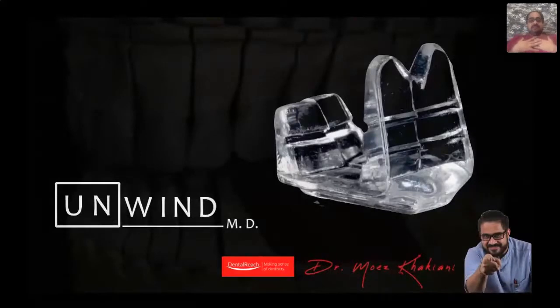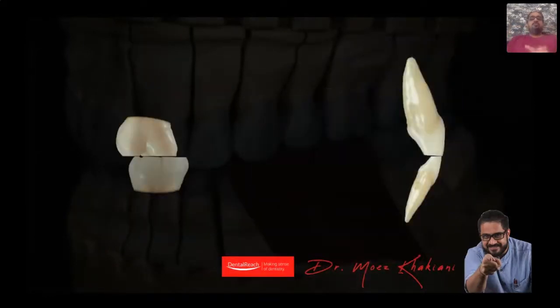I, in my practice, do this with the help of Unwind MD. It is a prefabricated anterior deprogrammer that I have designed myself. Its function, like any other deprogrammer on earth, is to separate the back teeth. Very quickly, let's look at how it functions. Just giving you a diagrammatic understanding here.